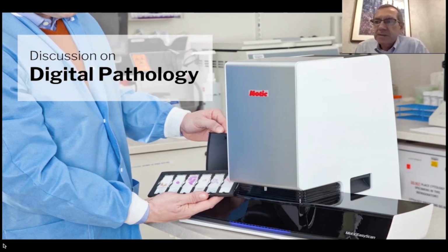Again, just to be able to provide better service. What we are trying to do here with the system is to bring the pathologist to the patient, not like it was done in the past, bringing the patient to the pathologist. This makes for better medicine, and is definitely an improvement in the service that we provide to the community.